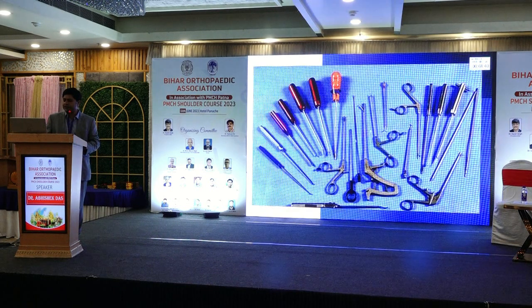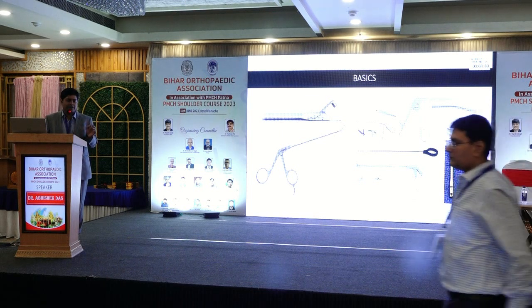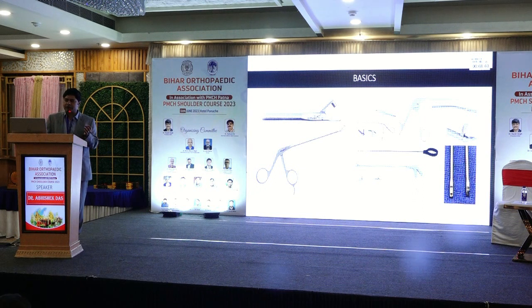These are a variety of instruments, but I won't go into detail of all of these. A few which you need are a suture passer, and this is a good one which has a bit of a hook on it, and it can retrieve your suture as well as tape, because when you are doing rotator cuff surgery, you need a tape retriever as well. Then you need a suture retriever, a grasper, knot pusher, knot cutter, and then something like a duckbill punch.